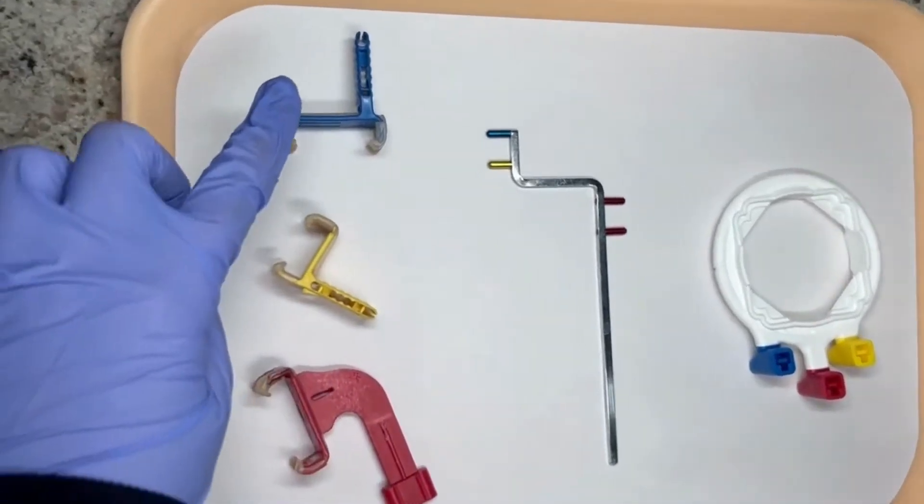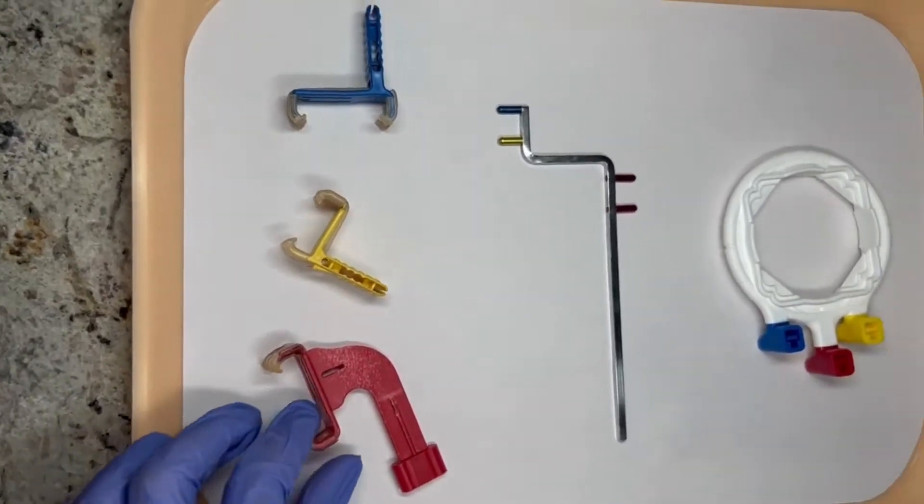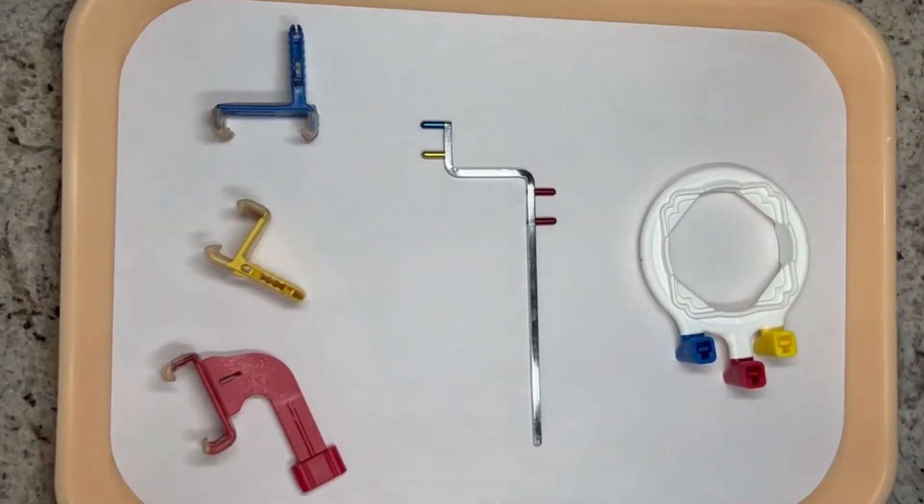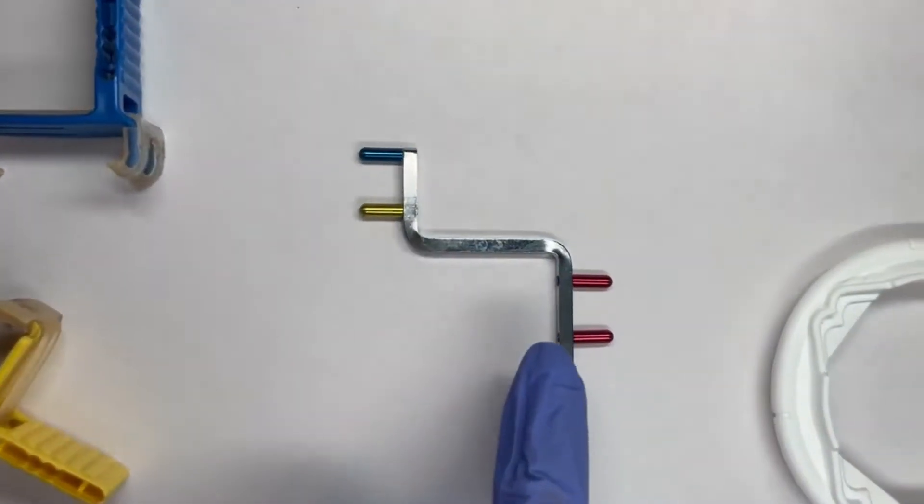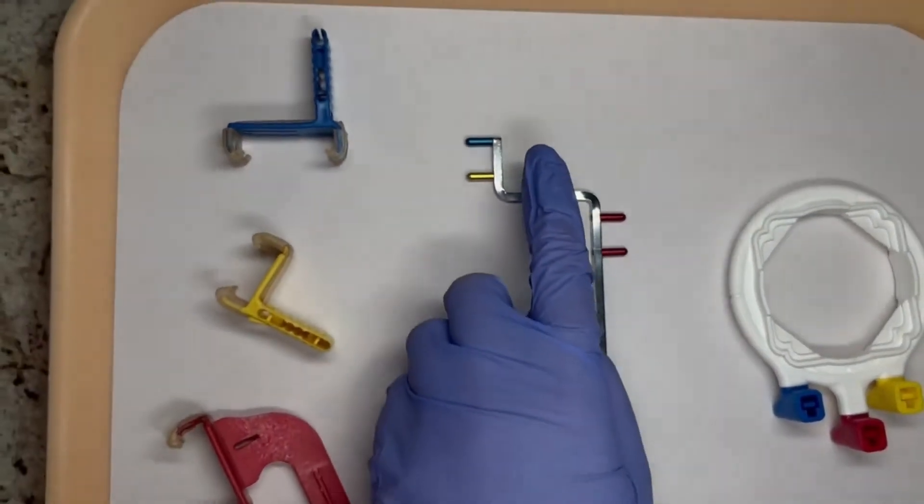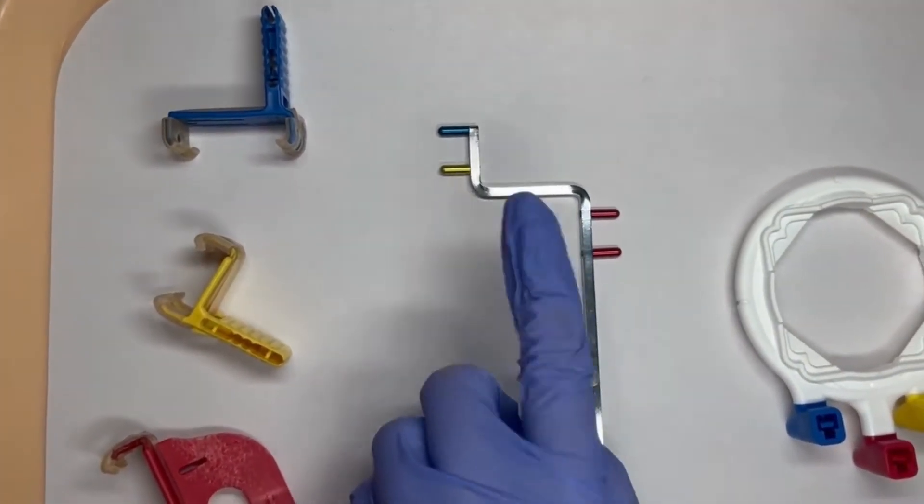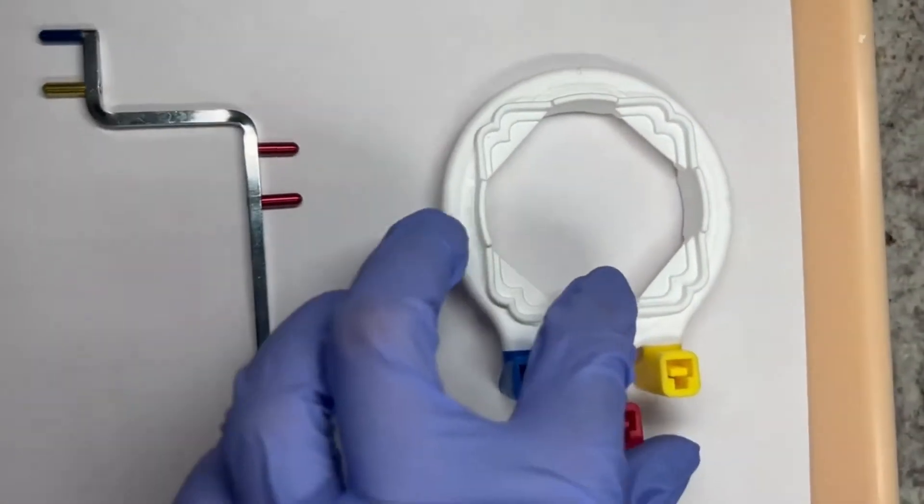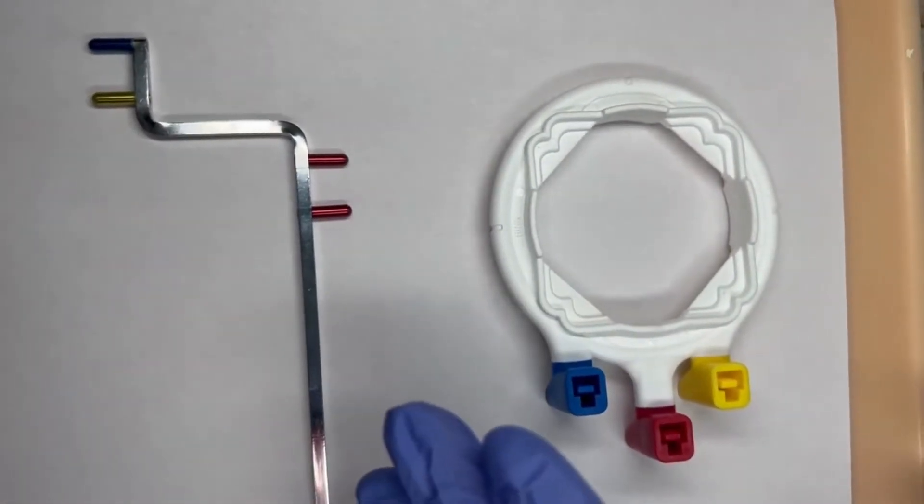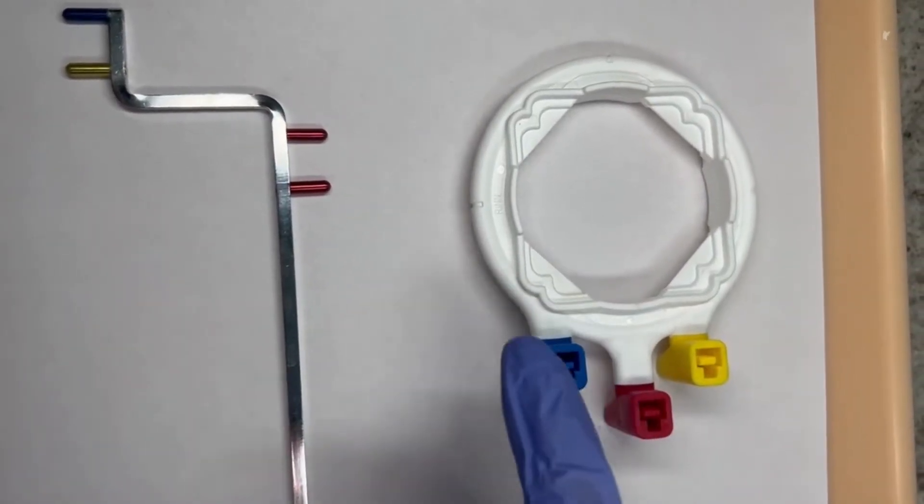We do still use the same three bite blocks that you would use for the three separate traditional ones, but as you can see we only have one arm instead of three separate arms and it shows you the different colors on here so you know which part to attach the bite tab to. Instead of three separate rings, we just have one ring to use with the three different colors which will tell you which arm to put it on.